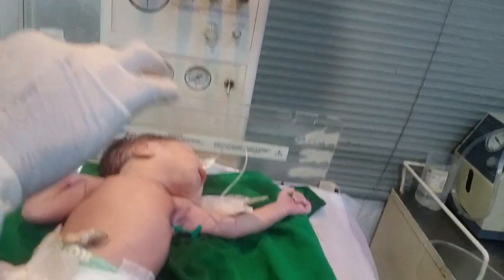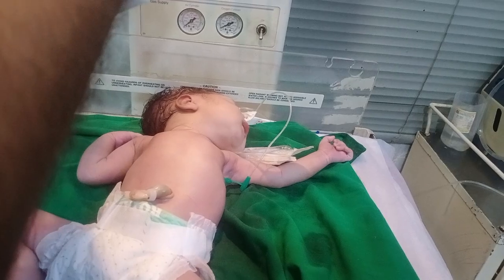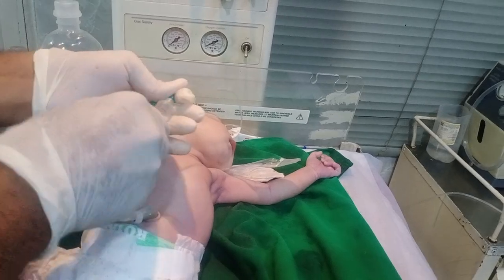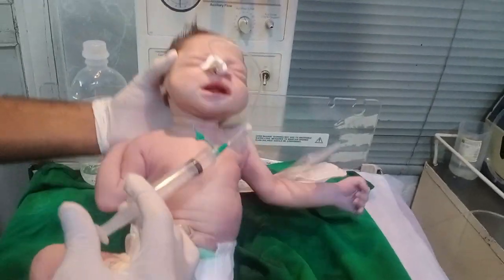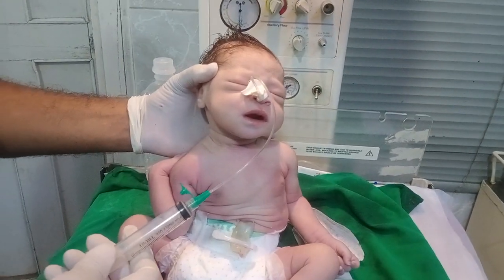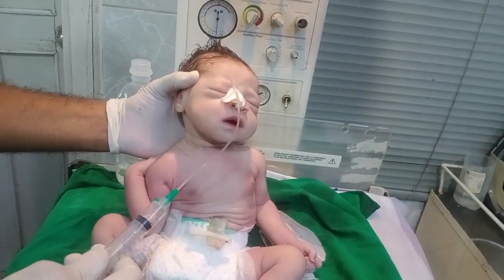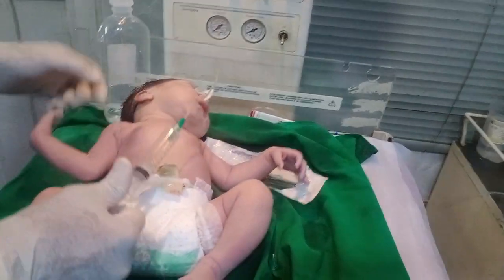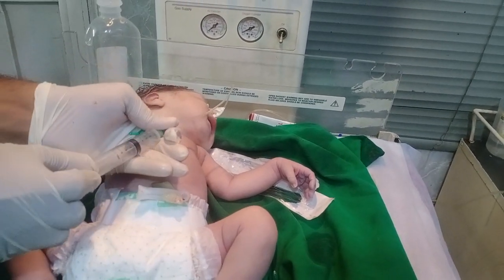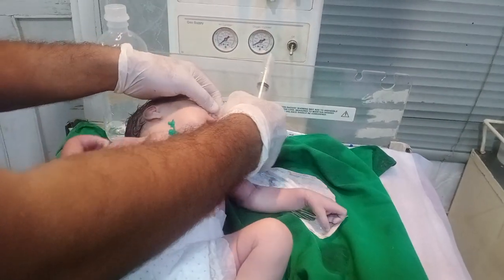Meconium is the first stool passed by the baby during or after birth. After that first stool, subsequent matter is known as normal stool. The baby is very cute, but if I do not expel the extra meconium, the baby will develop severe bacterial infection and very serious complications. That is why we remove it.